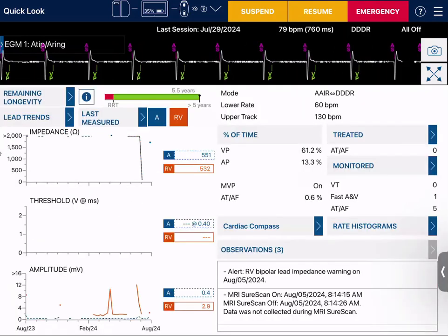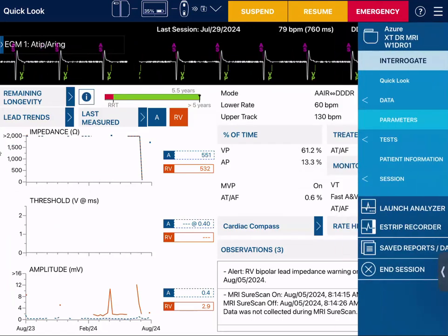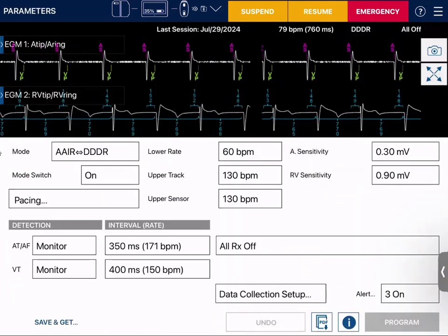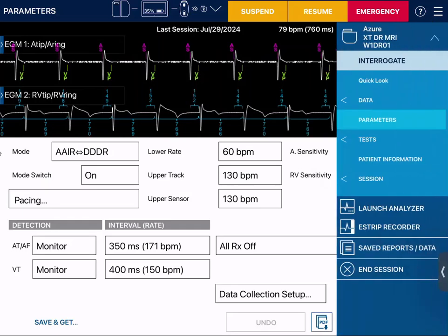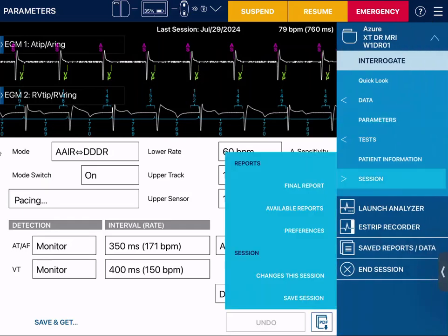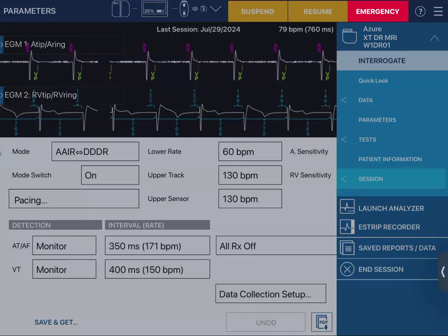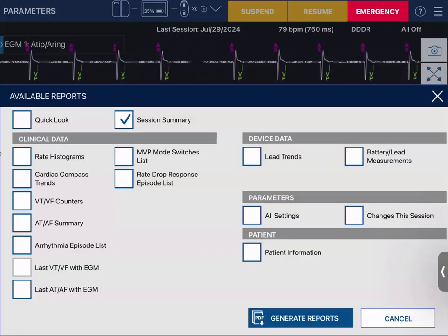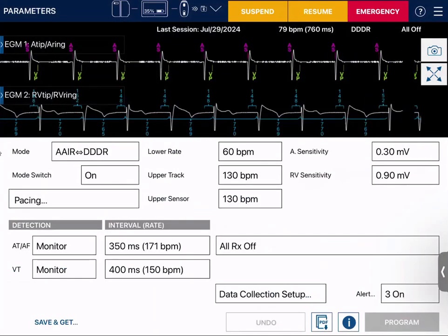Once all of that is done, if I want to make any changes I go into parameters. After making changes, we go to session, where we can do a final report or a session summary, generate a report, and print everything out from there.